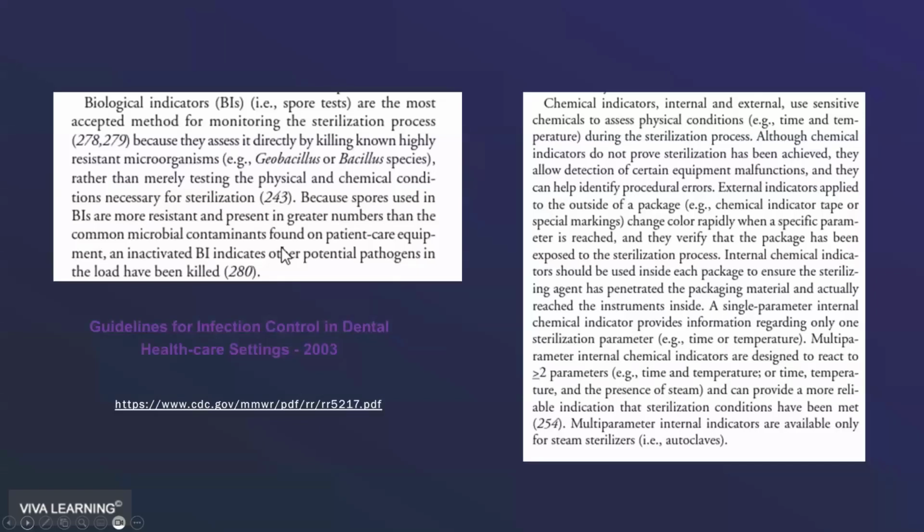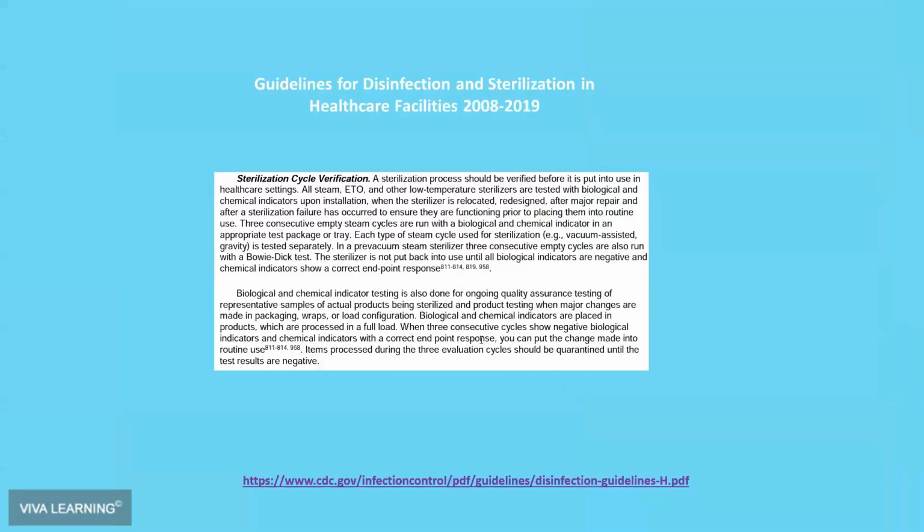So if you download a copy of either the CDC guidelines for infection control in dentistry from 2003 or the guidelines for disinfection and sterilization from 2008 and updated in 2019, you will see much the same information. So for anyone who needs to take that information back maybe to an employer or to someone that they report to, to prove that that is the standard of care, there's where you find that particular information.